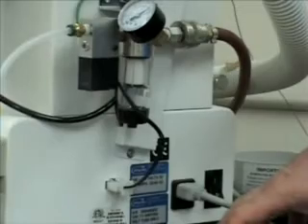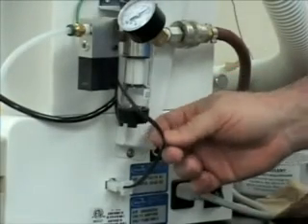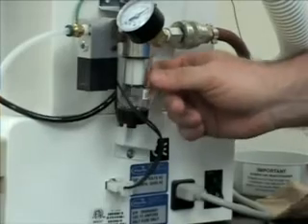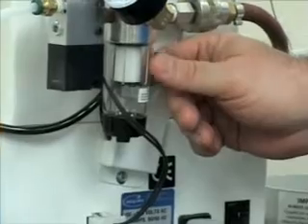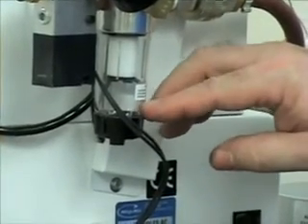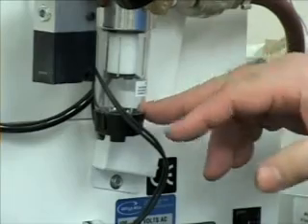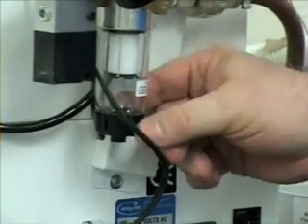Okay, the last regular maintenance item that you'll want to do on a routine basis, I would recommend weekly, is just on the back of the unit, inspect this clear plastic bowl for any evidence of humidity or moisture droplets, and especially if there's any accumulation of moisture in the bottom of the bowl. This is moisture that came in on the airline and has accumulated in the regulator catch bowl.